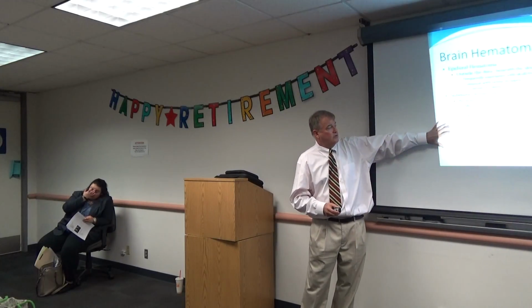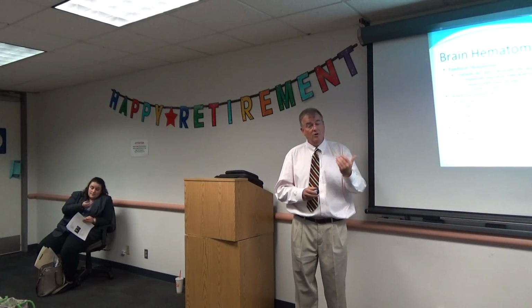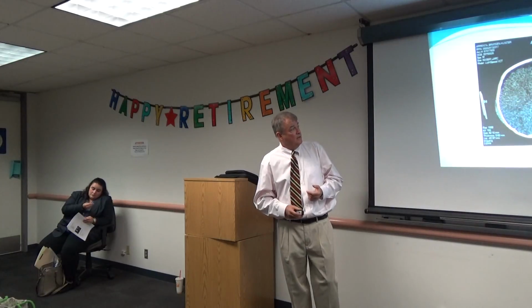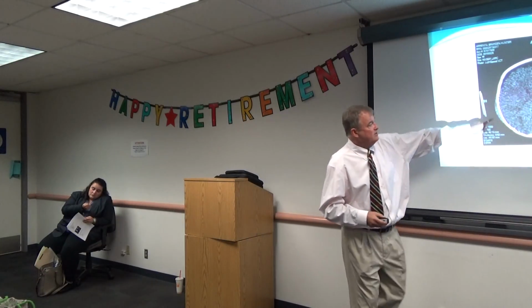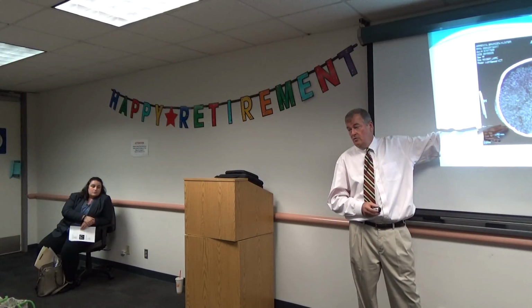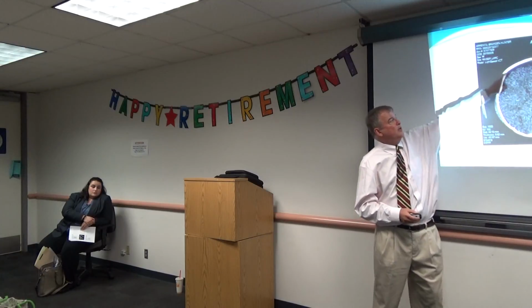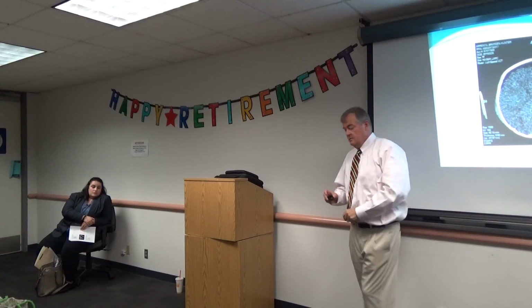Within the brain, we talk about bleeding within the brain, and that can be devastating to the child. Those are the things that cause swelling of the brain we call cerebral edema. So this is, when we get a CT scan, this is an idea. Now this is a different window. This is a tissue window on a CT scan. And you see the dark area on the very top? That's blood. And that blood sits inside.